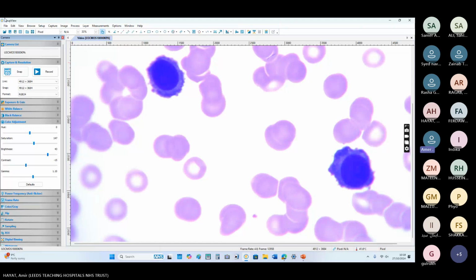This still represents plasma cell dyscrasia, and the history of previous multiple myeloma suggests that this patient has likely developed a spillover multiple myeloma. When you say spillover multiple myeloma, it means the patient has either become refractory to the current treatment or has relapsed after going into remission. So be ready for such cases in the exam as well.